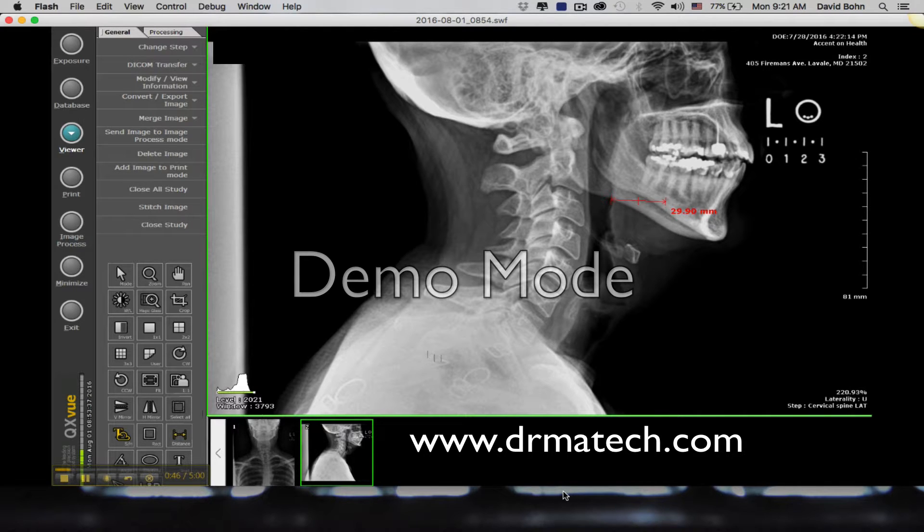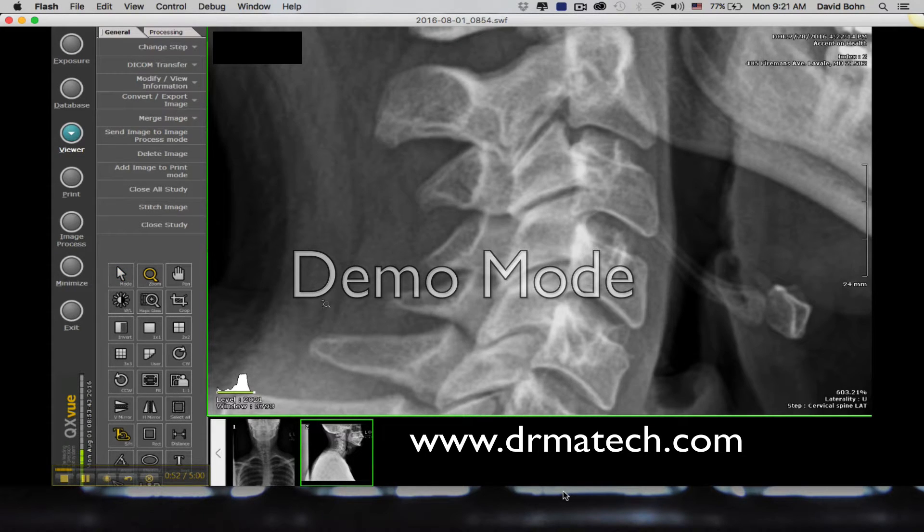If you can't with that scale, let me show you while we're on this. If it's difficult, one of the things I like to do is just zoom your image in. You'll find it's much easier to get down to the 30 millimeter area using a zoomed in image.